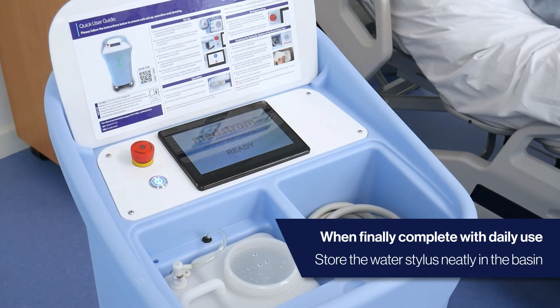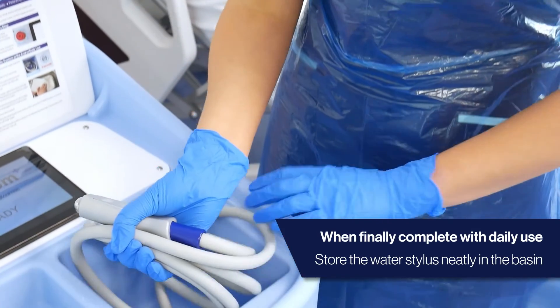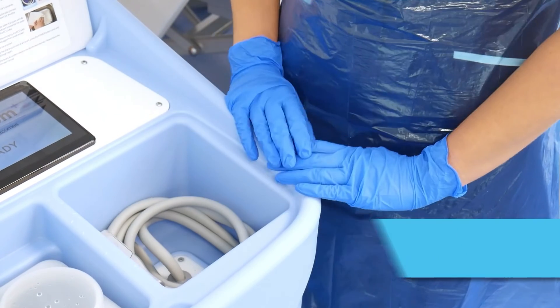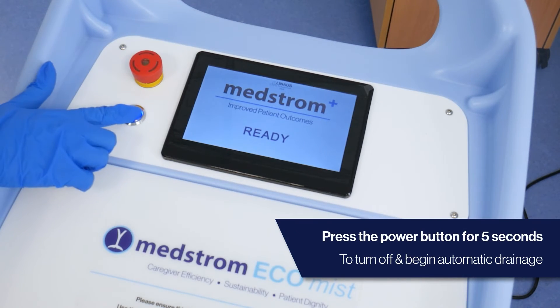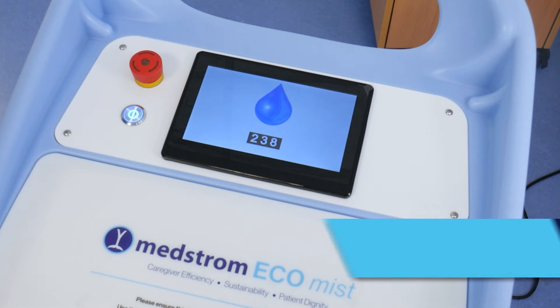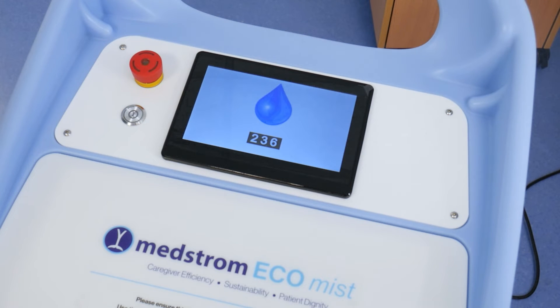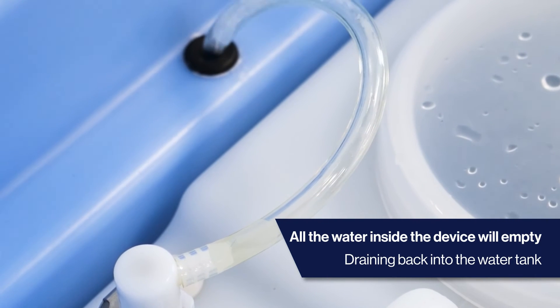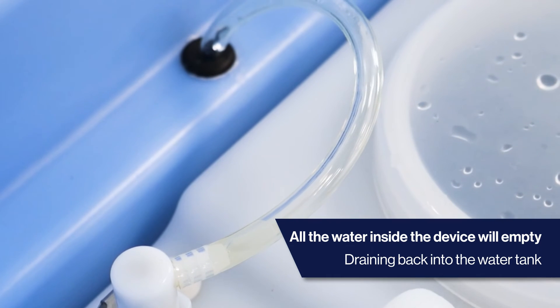Before turning the EcoMist off, ensure the water stylus is neatly secured into the basin area. To turn off, press the power button for five seconds. The EcoMist will then begin the automatic process of emptying the internal water system, i.e. the tube connected to the water stylus.